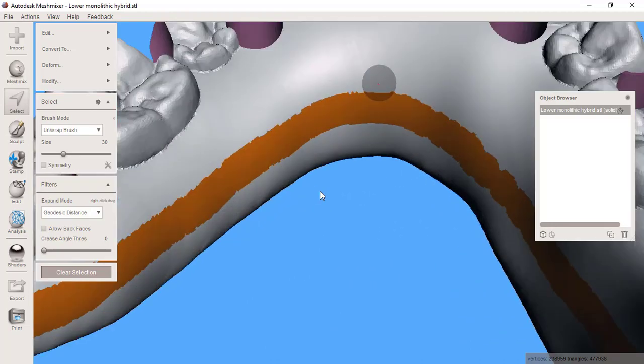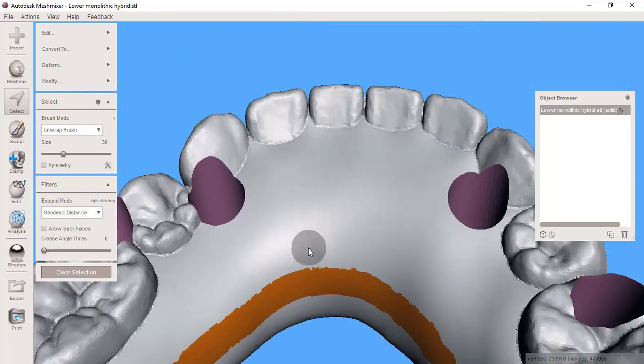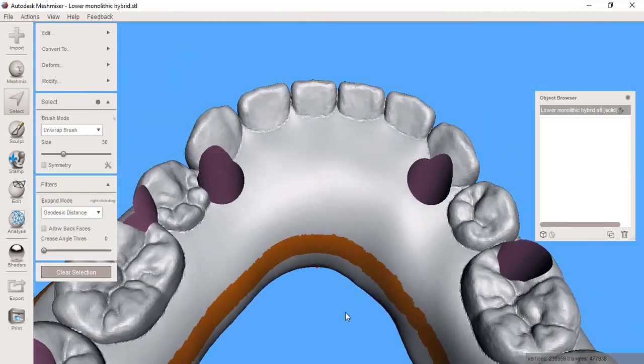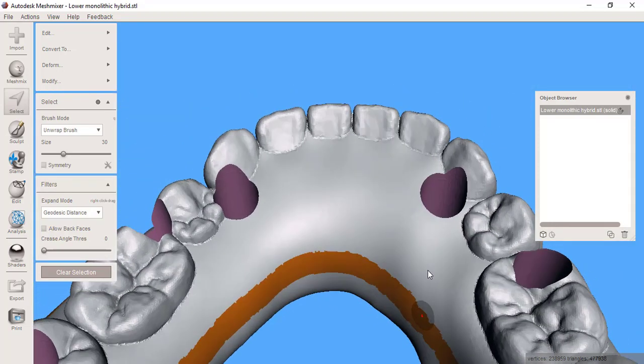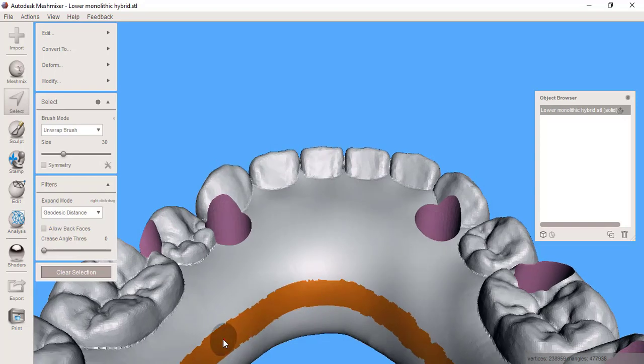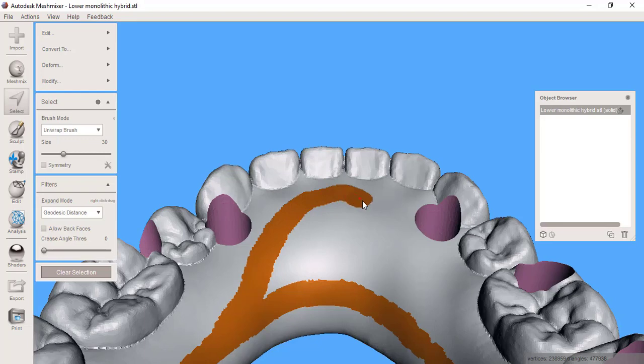The weakest point in these is always right up here at the midline where it makes the curve, so up here I'm going to do an additional circle to add more reinforcement in this area.